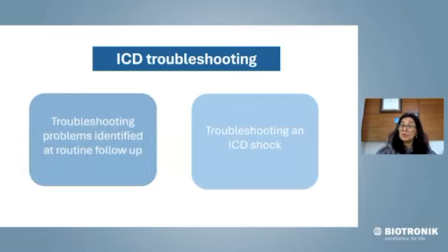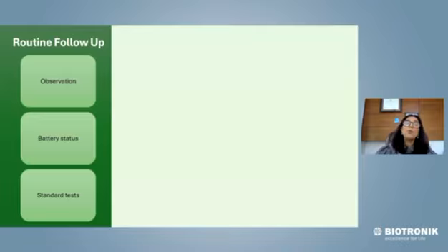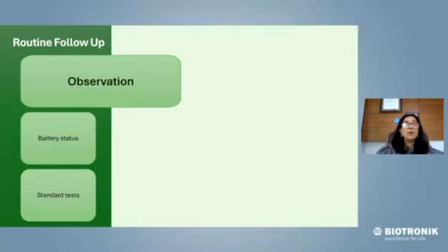Remember, the troubleshooting problems are identified at routine follow-up and, of course, troubleshooting in ICD shock. What happens on routine follow-up when a patient comes immediately post-implant and, of course, on subsequent follow-up?